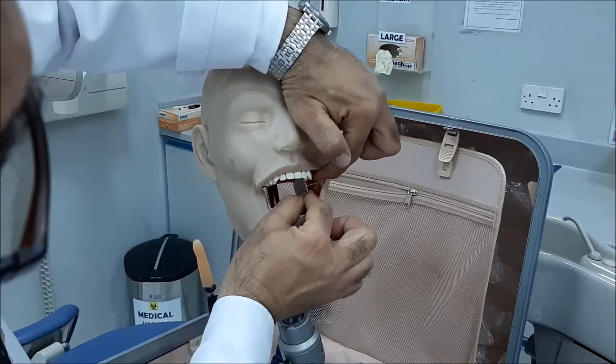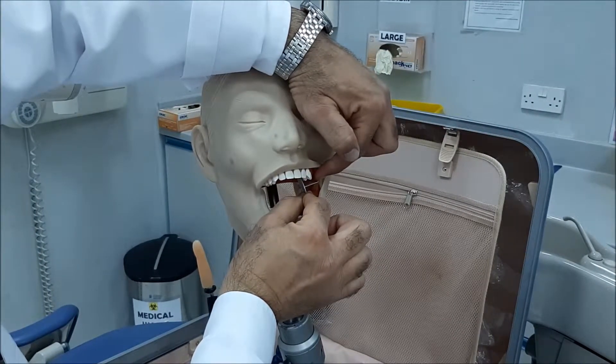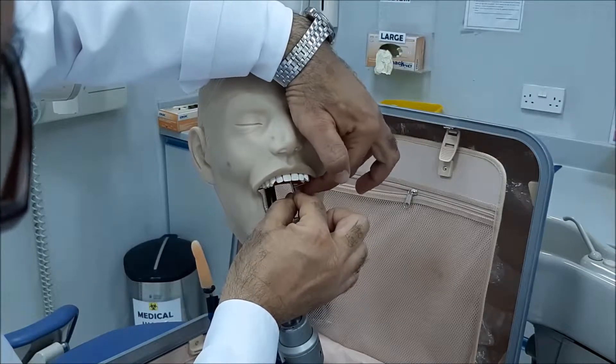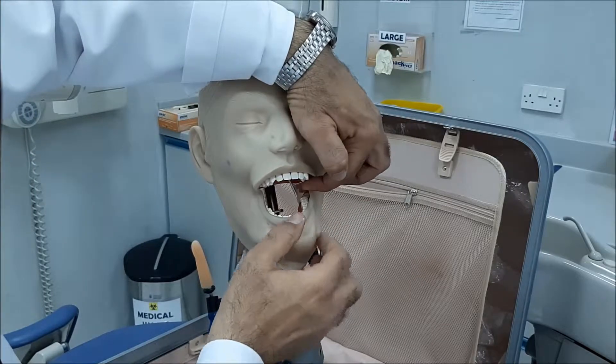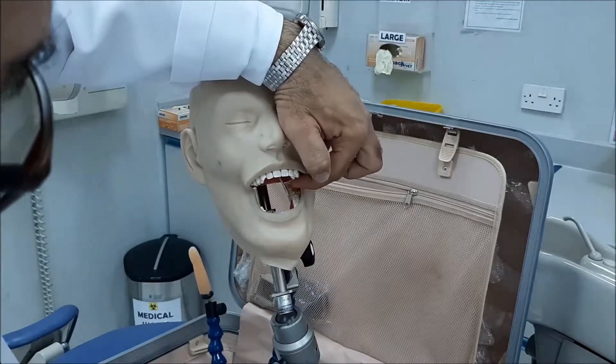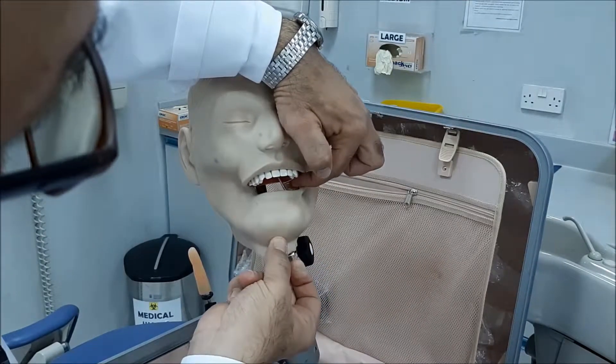When you place it, don't push it buccally, because you will not have space for the patient to bite. Try to make it go as much as possible toward the midline. So the second molar is biting, and when you ask the patient to bite, he or she will have space to bite.